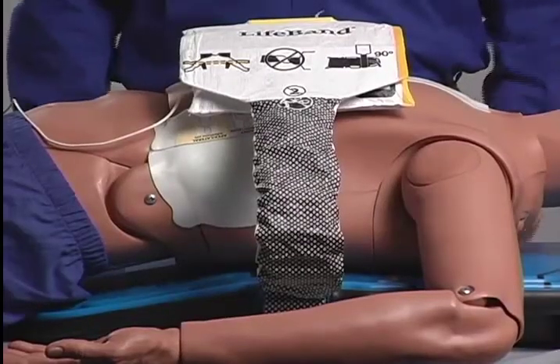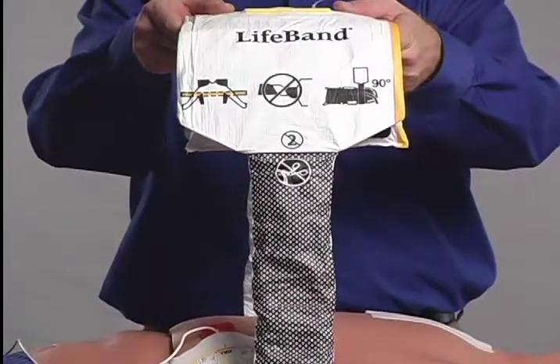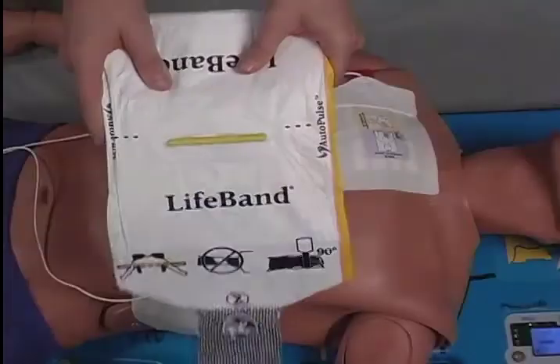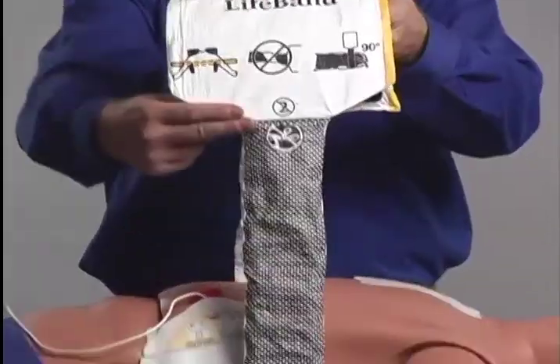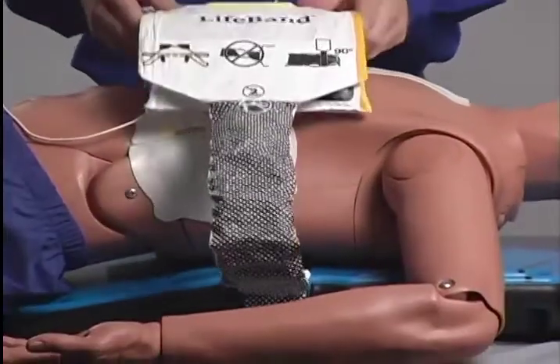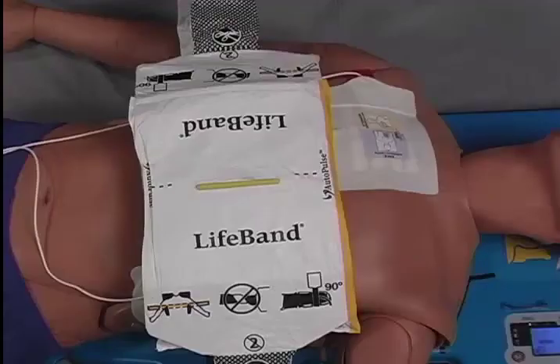Pull the assembled life band up to its fullest extension to set the internal motor to its starting or home position, and while doing so, ensure that the bands are not twisted and they are at a 90-degree angle to the board. Place the life band on the patient's chest, ensuring that the yellow alignment tab is placed over the spot at which you would normally perform manual chest compressions. Once the life band is properly placed, press the green Continue button.